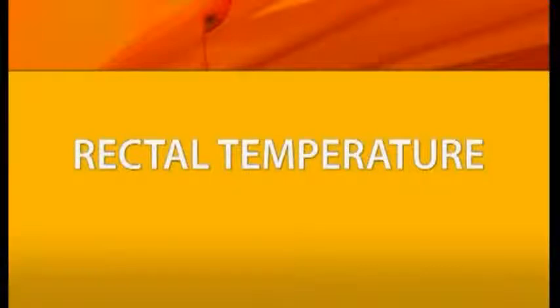It is very rare that you will be asked to obtain a rectal temperature. Always receive resident-specific training from your medical professional before performing a rectal temperature reading.